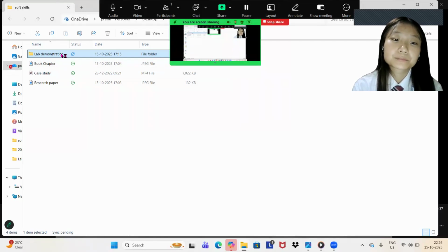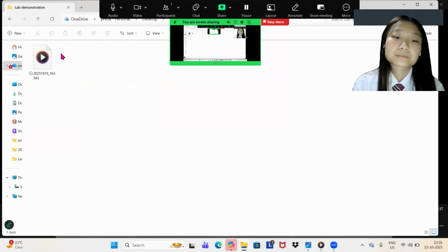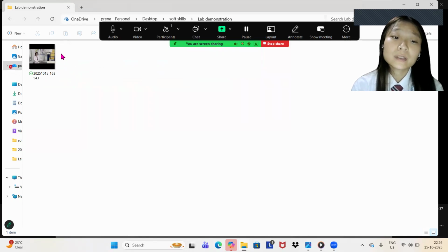So now I will be showing my lab demonstration related to the topic foreign object found in X-ray.